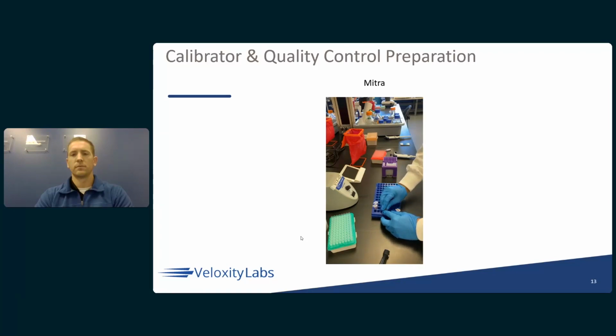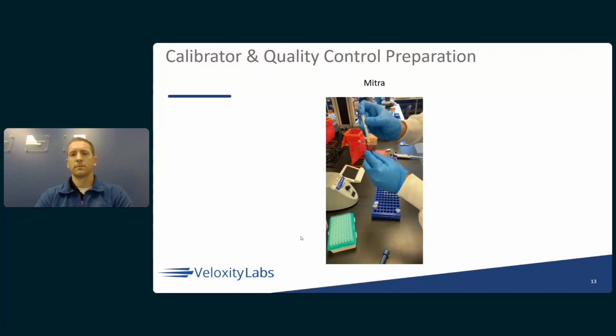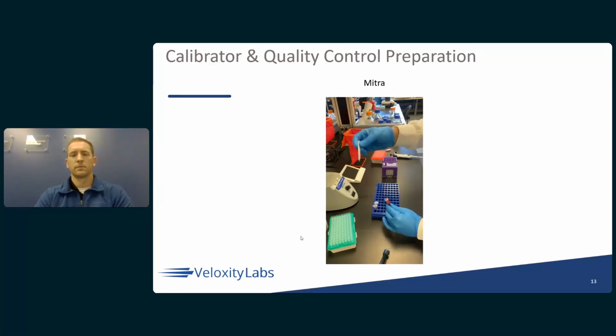After that's equilibrated, we would open the tube, and in this case, we're using the Mitra. We would submerge the tube into the blood just to break the surface and allow the capillary action to work for it to fill. Once it fills, give a 1 Mississippi count. Make sure to keep the tip nice and vertical, and you'll see that the tip has filled completely. Now I would take the tip. There's no leaking of any blood. I would put it in the clamshell to dry overnight.